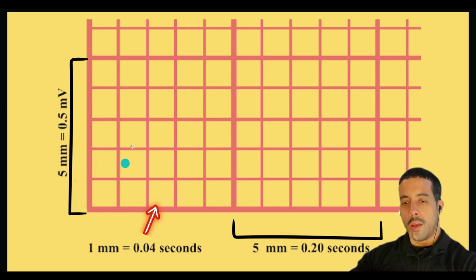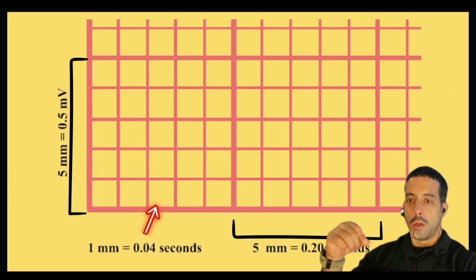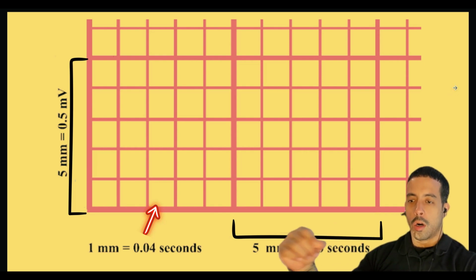And the waves that are going up, if you notice in the previous slides, the P wave is smaller than the QRS. That's because the amount of millivolts needed to make the heart contract is a lot higher, and that's why that spike is higher. So when we talk about 12 lead EKGs, it's good to make sure you guys have that part clear.